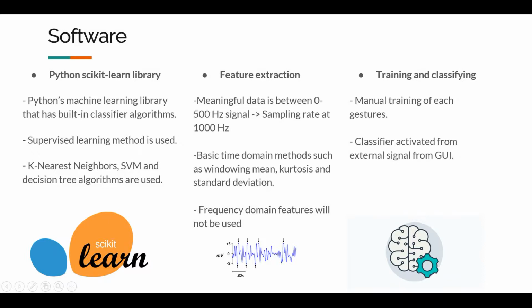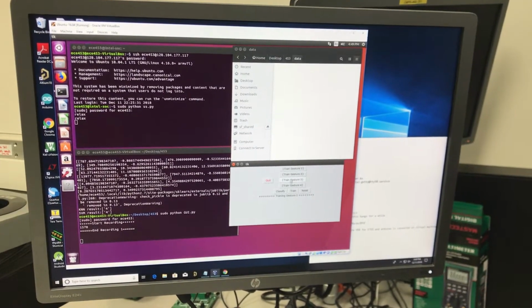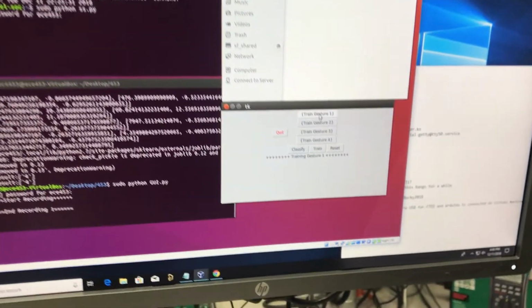As I said before, the sampling rate is going to be at 1000 Hertz because the meaningful data is between 0 to 500 Hertz signal. And then basic time domain methods such as windowing mean, kurtosis, and standard deviation are going to be used as features. Okay, so this is our GUI interface, and we're going to train each of the 4 gestures 3 times.